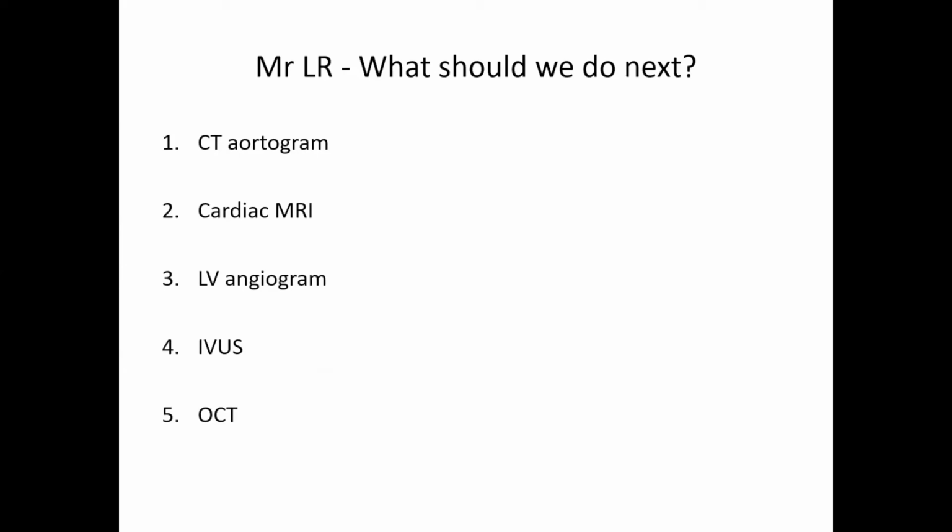I think this year we are all biased with OCT. Yes, it's an OCT presentation. I actually had to cut a few cases from in between because there were some cases where the answer was not OCT, but unfortunately, due to time, I had to cut those cases. So, let's see what the answer is.